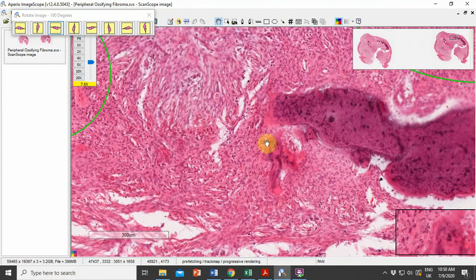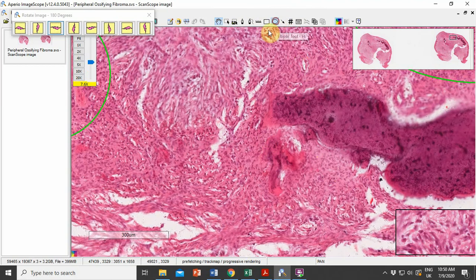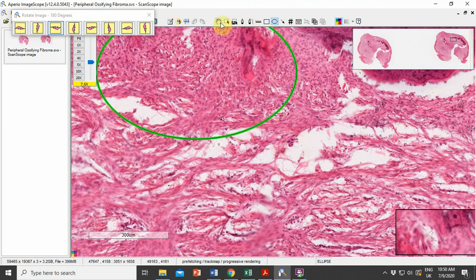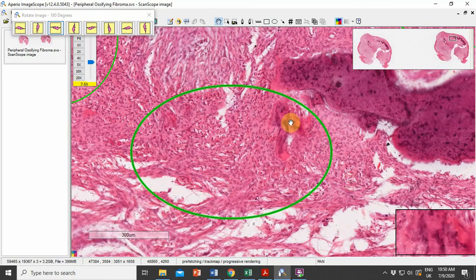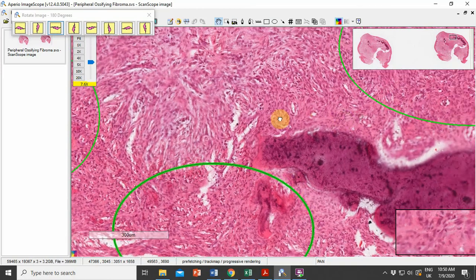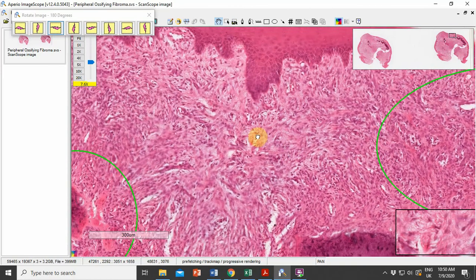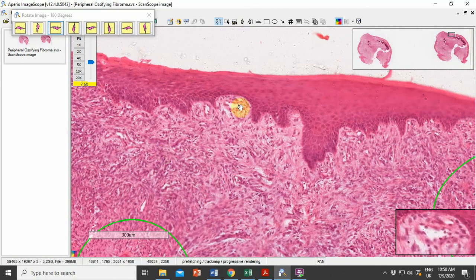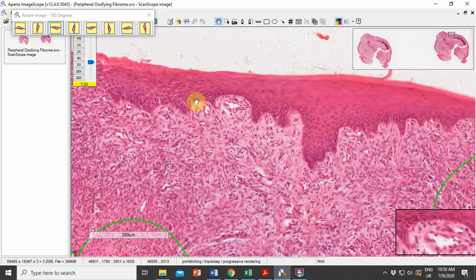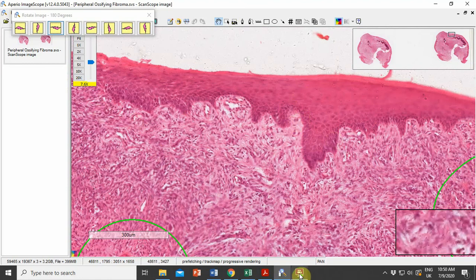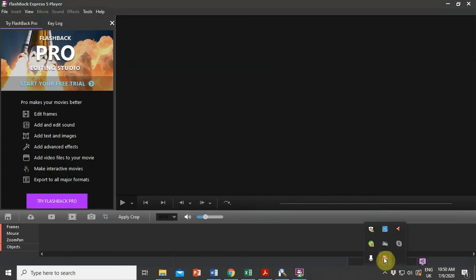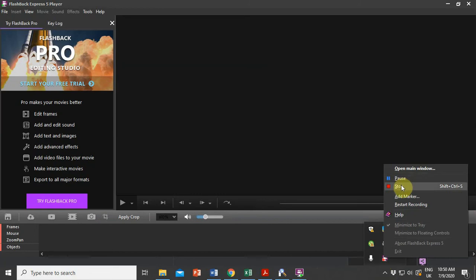As we move towards the superficial aspect, we can see that there is an increase in cellularity and the appearance of bony trabeculae and areas of mineralization, which are covered by the overlying epithelium.